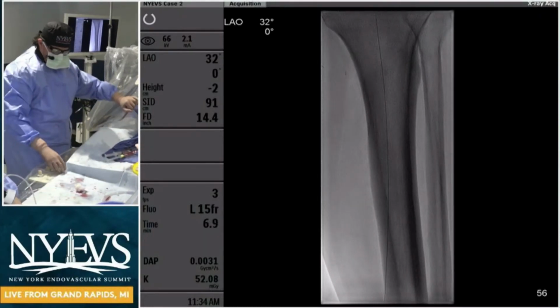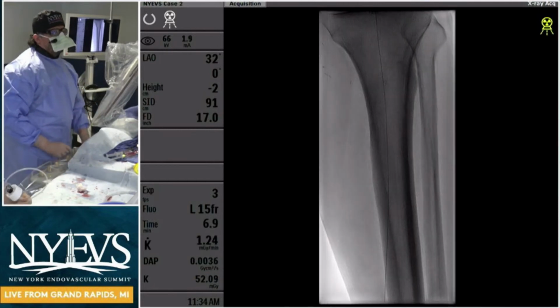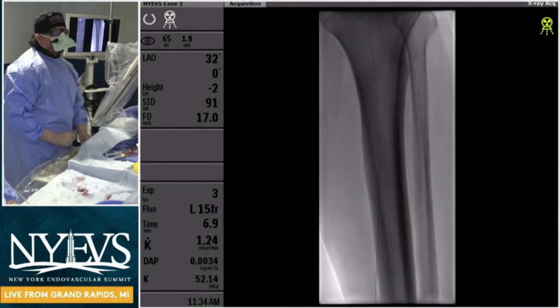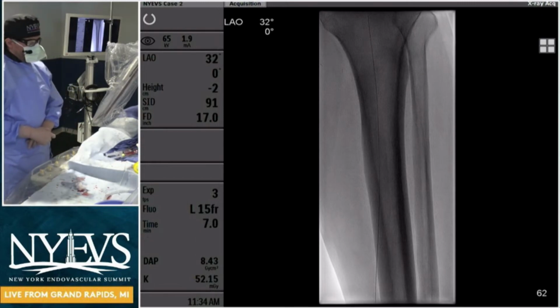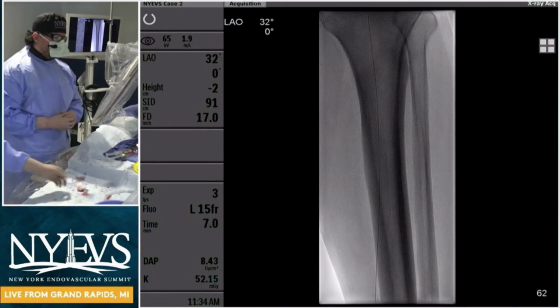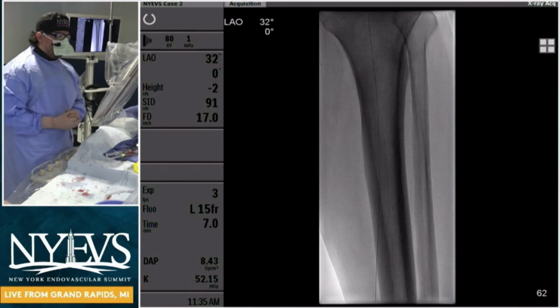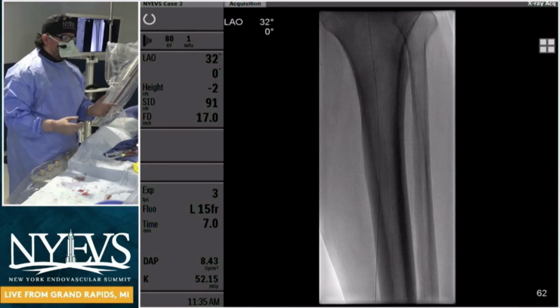So I agree with you. I think these trials are small, but they definitely give a signal toward an advantage or benefit. But I think a larger trial looking at the usage of IVUS across multiple beds is needed also, right? This IVUS might not make a difference in large iliac vessels where you use an 8 millimeter versus 10 millimeter stent.